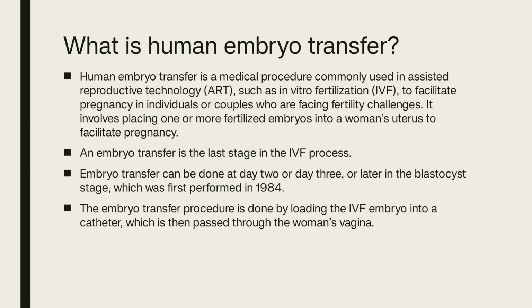So what is human embryo transfer? Human embryo transfer is a medical procedure commonly used in assisted reproductive technology (ART), such as in vitro fertilization (IVF), to facilitate pregnancy in individuals or couples who are facing fertility challenges. It involves placing one or more fertilized embryos into a woman's uterus to facilitate pregnancy.